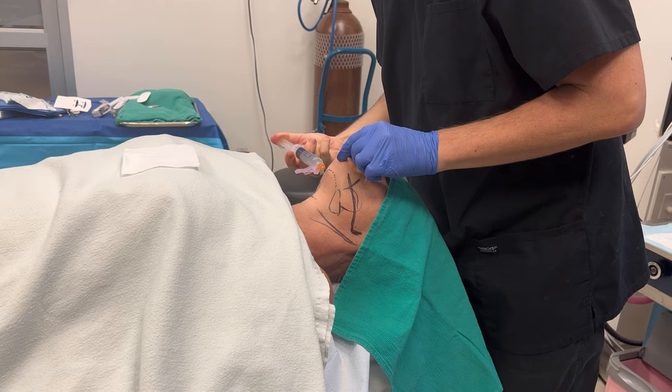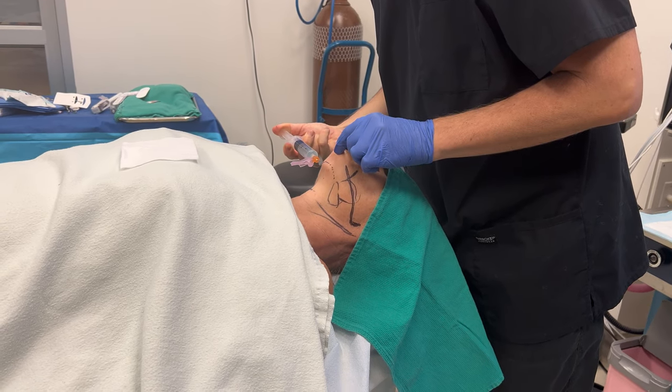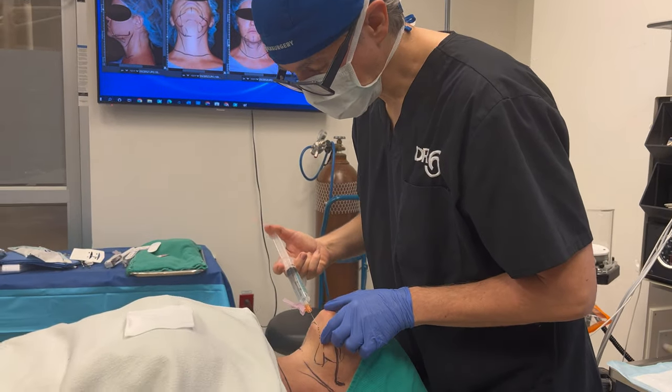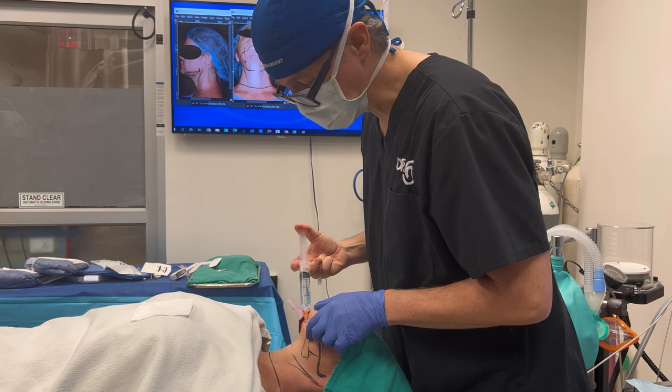Just a little freezing going in. Freezing stings when it goes in, and then after a few seconds it's going to be all numb. The whole neck area is going to be completely numb, and that's what allows us to do this awake.